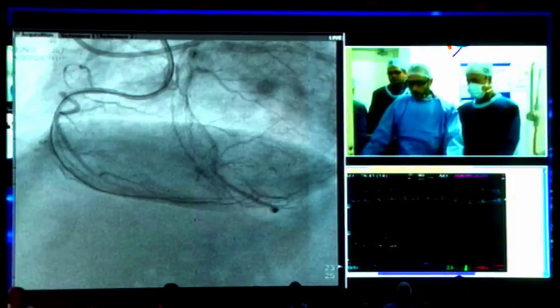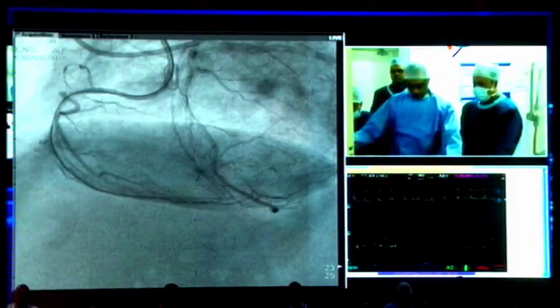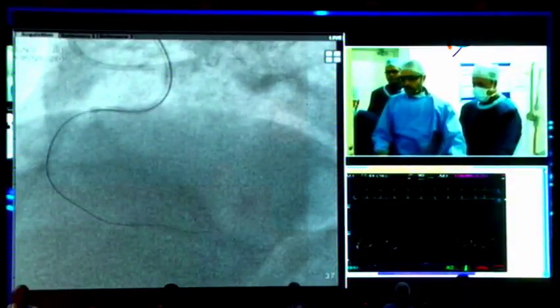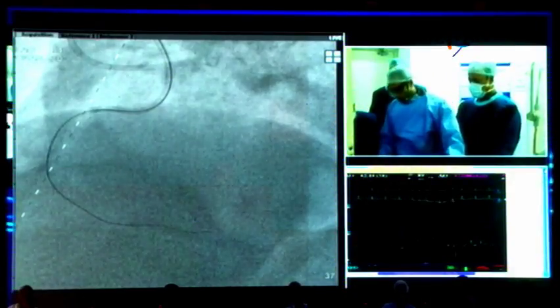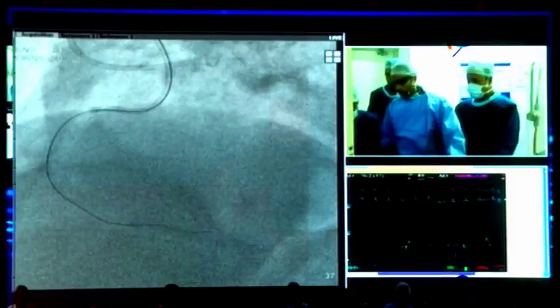How is the RCA injection going? I think the distal part of the RCA is not very clear. No, but you will not. I just want to see where the takeoff of the true RCA is, not this branch. Well, besides contrast and a little bit more radiation, there's no downside, so I'm just going to go with Dr. Rad's suggestion. Just give me an injection, let's see. He wants to? Sure, why not?